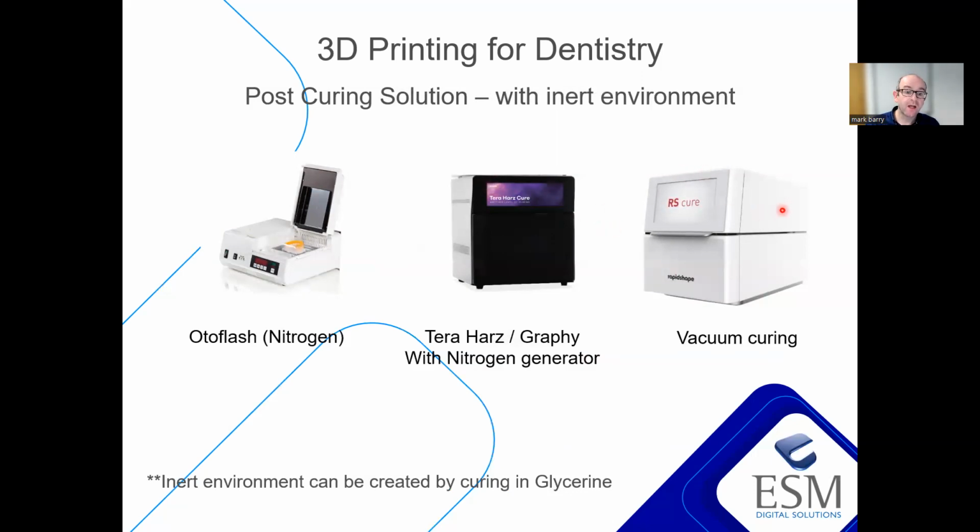Very smart solution. We've then got Rapid Shape. They have a really neat solution as well. They're vacuum curing. So they suck all that air and oxygen out of the chamber whilst the curing happens.